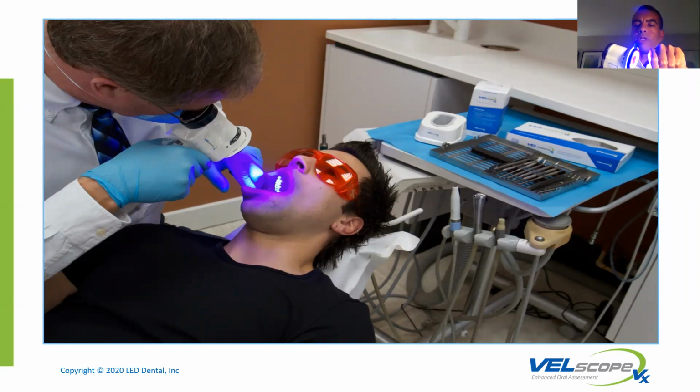Up and down, left and right, for the mouth, back of the throat. This light is not like a curing light, so you're not concerned about damage to your eyes, but it is bright. So if you haven't tried it yet and for whatever reason pointed it the wrong direction, you may see some stars. We provide goggles for the patient for patient comfort, but again, this is not like a curing light, so you don't have to be concerned.